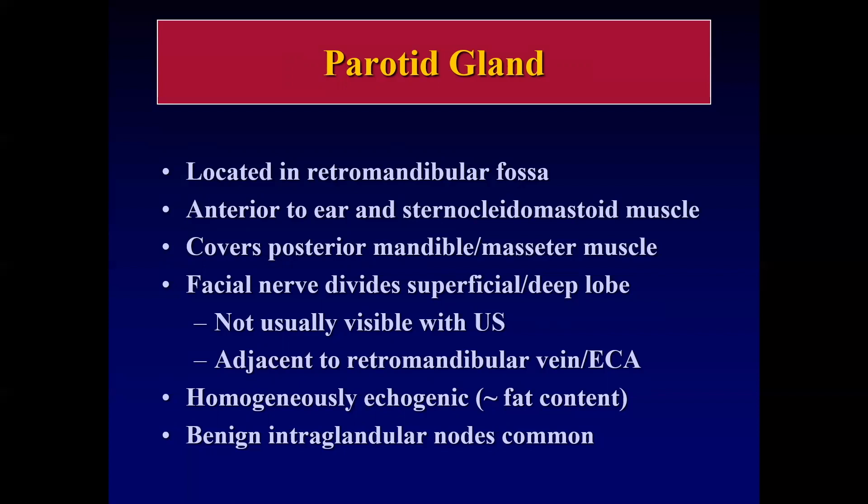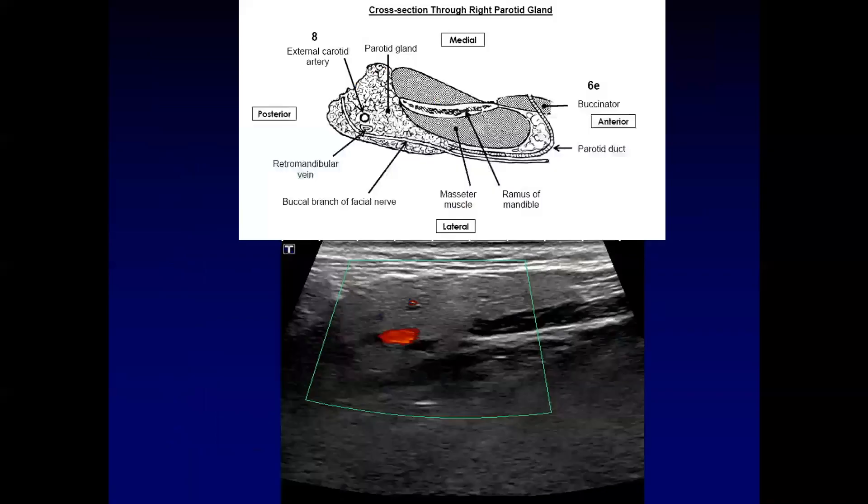The salivary glands are normally homogeneously echogenic, and the amount of echogenicity depends upon the fat content of the gland. It's also worth noting that benign intraglandular nodes are common with regard to the parotid gland.